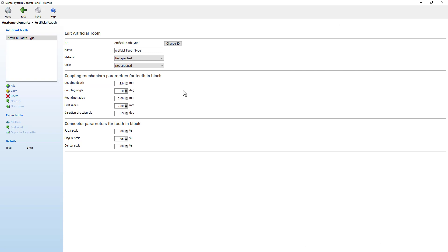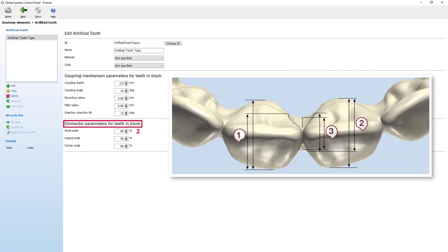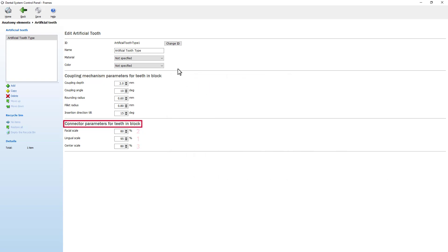As well as set the connection parameters for teeth in block, like the amount of facial scale from its initial shape taken from the tooth silhouette, the amount of lingual scale from its initial shape taken from the tooth silhouette, and the amount of the connector scale controlling its concavity.